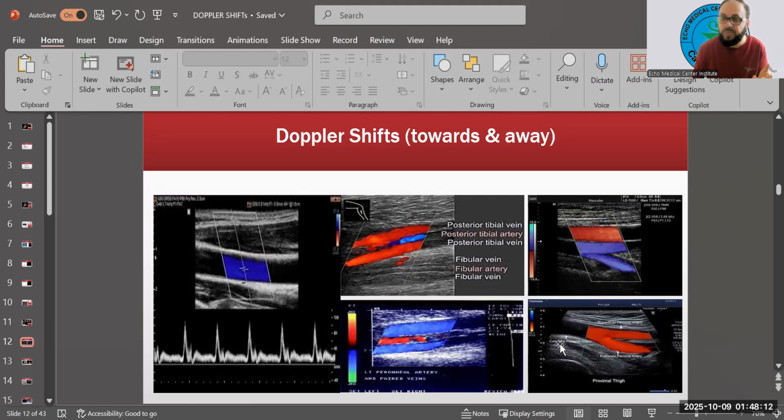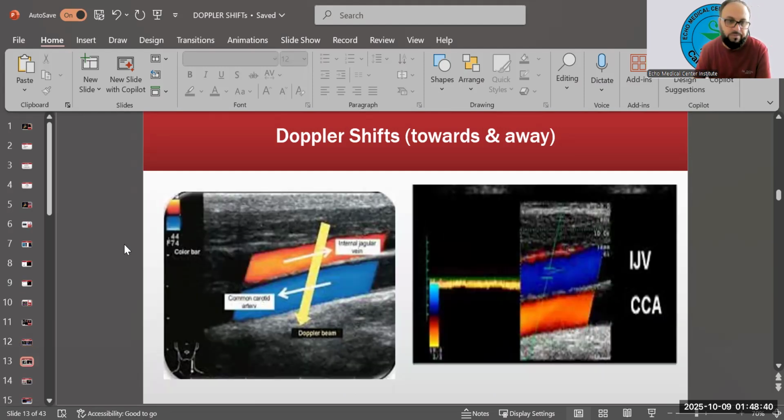You can see here, these two pictures are almost the same thing. Earlier we talked about this SFA, and look at here, SFV. Now if you look at here, technically it's supposed to be blue, but we cannot represent it. And this is technically supposed to be red, but we invert it. So it is inverted. That is allowed. That is a legal move. You can do that, no problem.